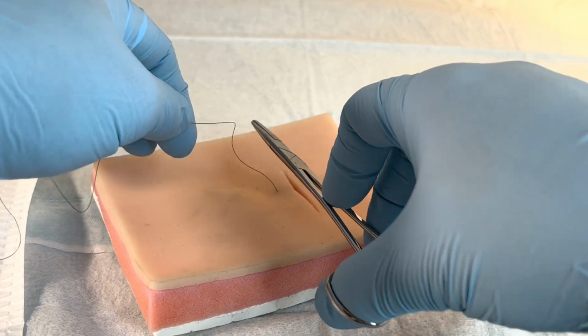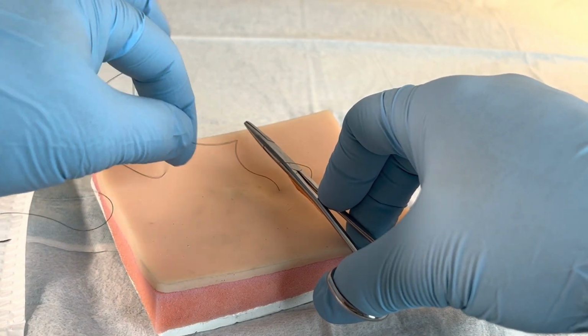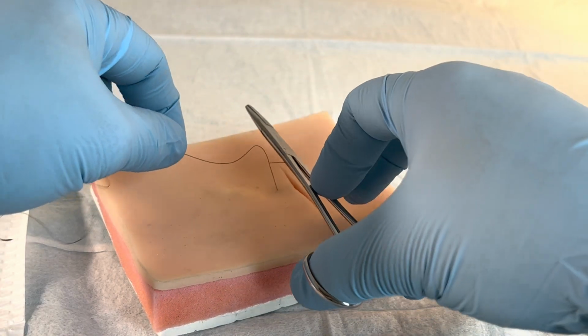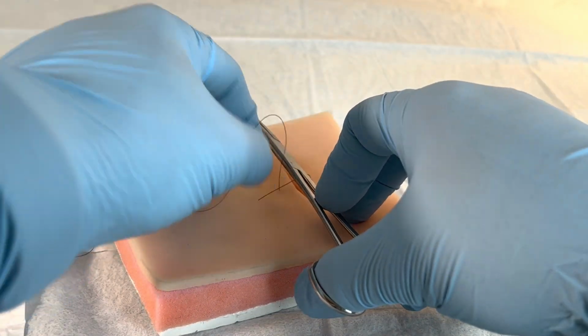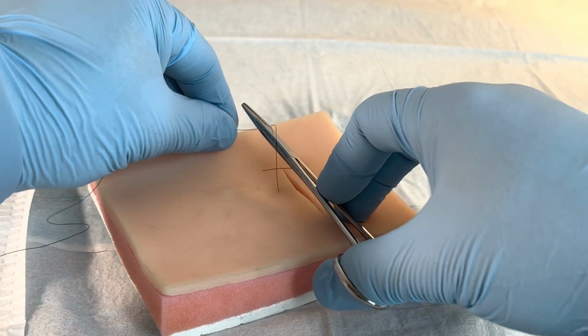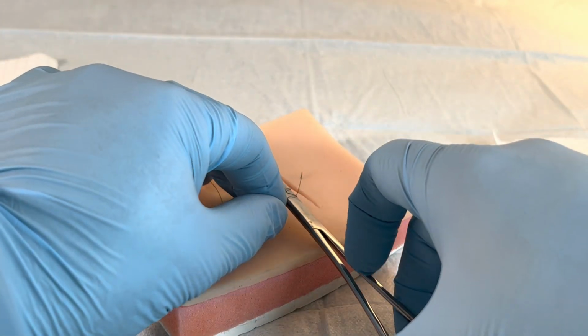The first throw is a surgeon's knot, so that's 2 loops. So I'm always throwing the lead edge over the wound. So instrument driver over the wound, parallel, grab the lead edge. First knot I throw twice, once over, twice over. I keep a little tension there so it doesn't slide away.